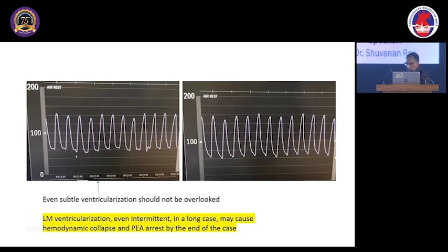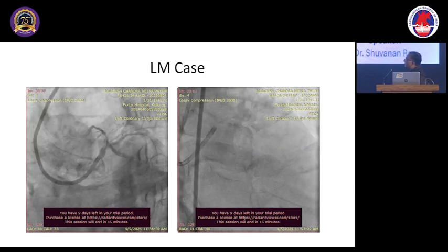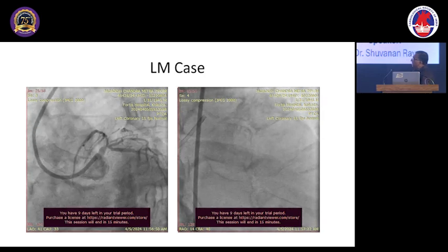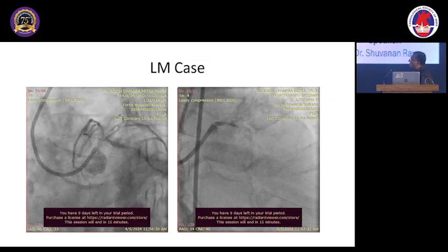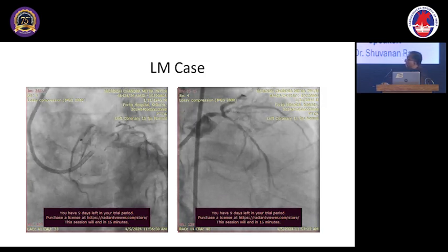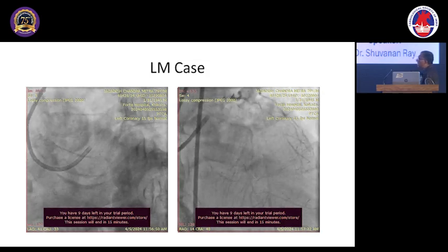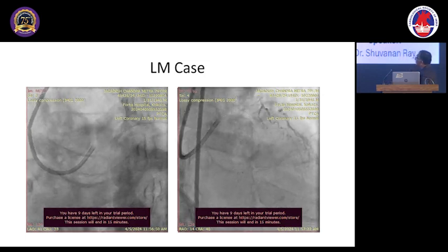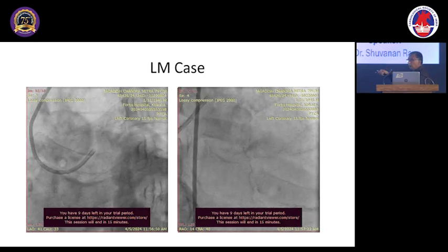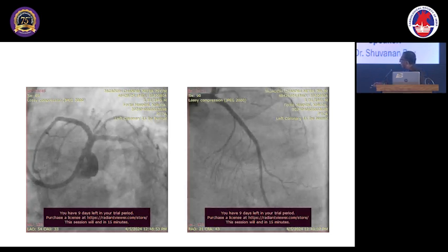These are the collateral circulation. This is again a theoretical subject, but you need to know that the collaterals are important for CTO recanalization, and the most important collaterals are the septal collaterals. Normally, there are septal and epicardial collaterals, and there is a ratio between them. If the septals are more, then you can see the arteries according to the septal circulation. If you see the artery very well with septal, it can be easier for you to go through the septal into the blocked artery. But if the epicardial artery is larger, then the septal will be less. So in that case, we took a septal, and you see where we went through the septal and entered into the main artery. This is called septal surfing. You just put the wire across, and then you put the microcatheter up.